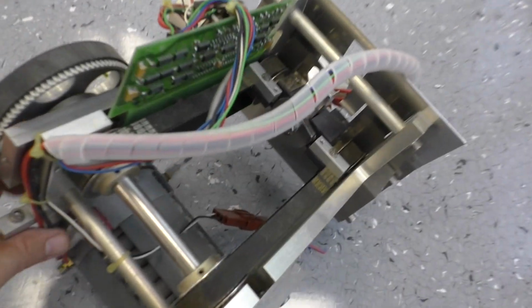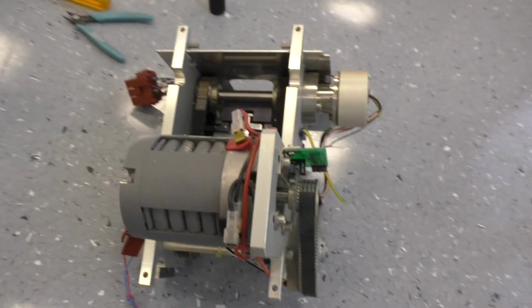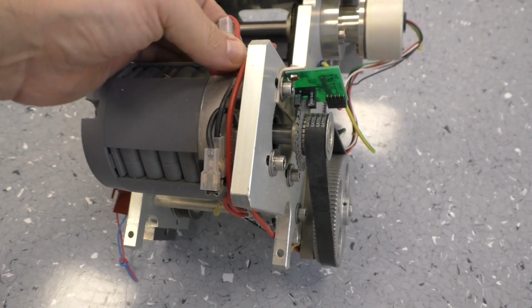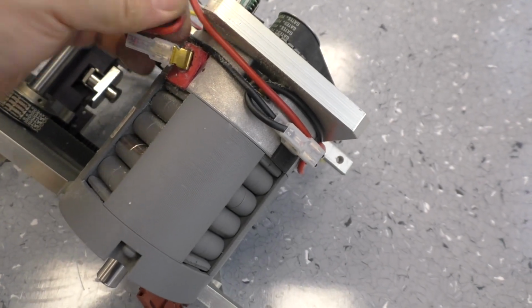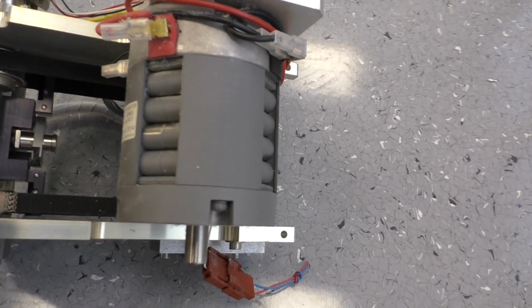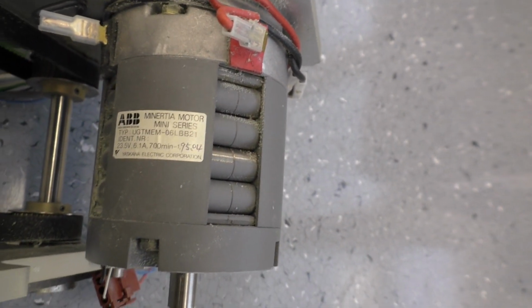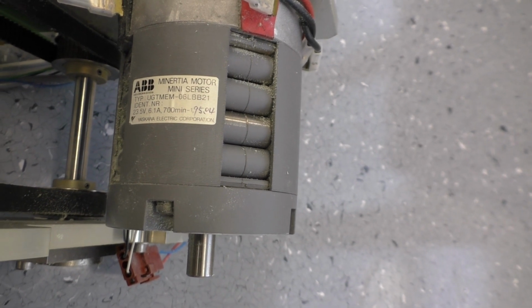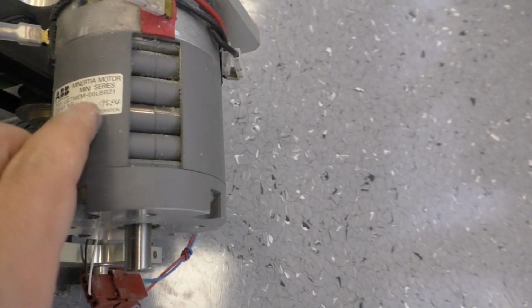Okay, let's have a look at the pump here, or the pump drive. It's not the entire pump. So I'm a little bit surprised that this is not a stepper motor. This looks like a regular DC motor, which has already seen better days. I don't think that I have damaged this here. I just took it out. So maybe someone else has already screwed around. From ABB. Asea Brown Boveri, or, well, it's a Japanese brand, as you can see here.